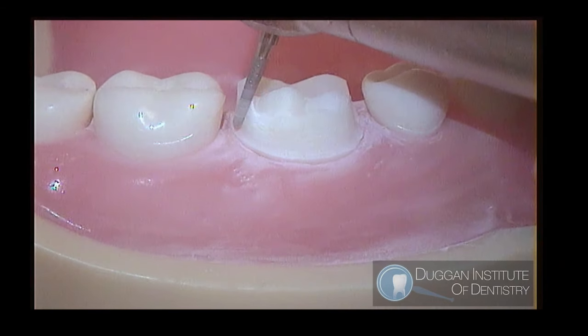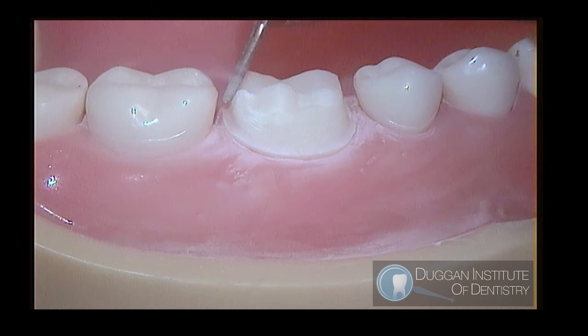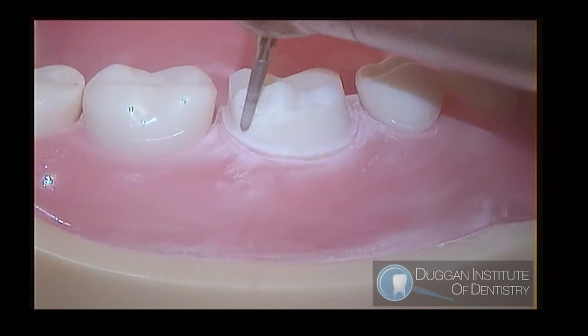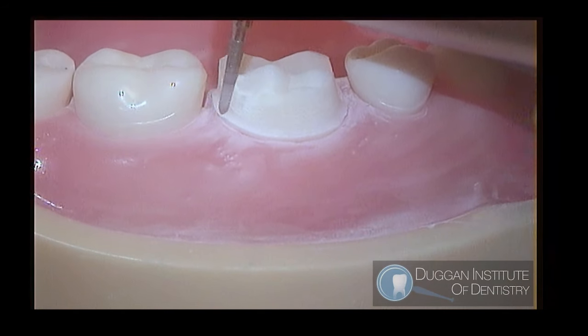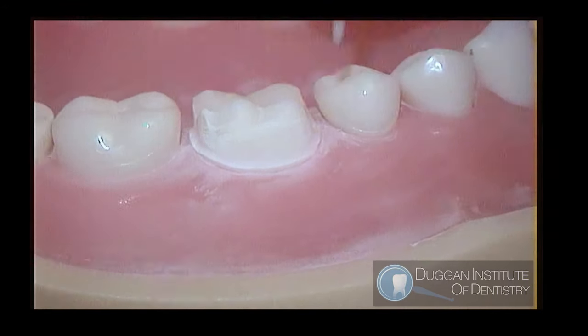Now we place the secondary plane, which is located on the occlusal 1/3 and the middle 1/3 of the buccal surface. Place the secondary plane just below the functional cusp bevel.